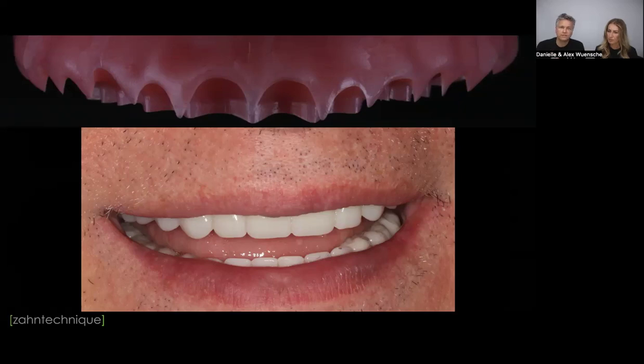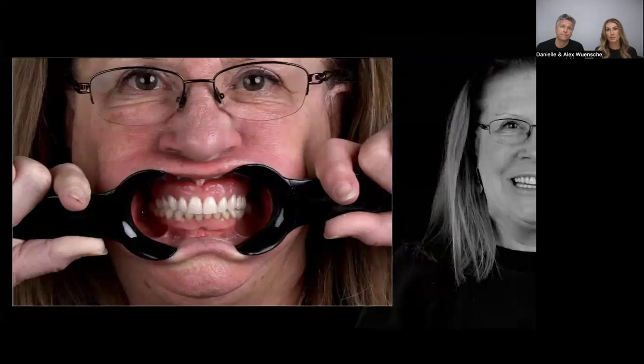For me, one of the main reasons is, well, what if something goes wrong? The analog process always can rescue us out of the situation. And I think it's very important to always have a plan B. The plan B is sometimes analog or digilog, and we still can finish, still satisfy the patient, and still everybody's happy. So just keep that in mind. If you don't know the analog process for certain ways you do digital right now, I highly encourage you to learn these analog processes, so that you at least know what to do if something goes wrong. And we're here to also help you if you have any questions on the steps and procedures.